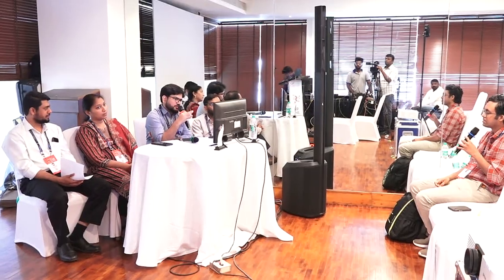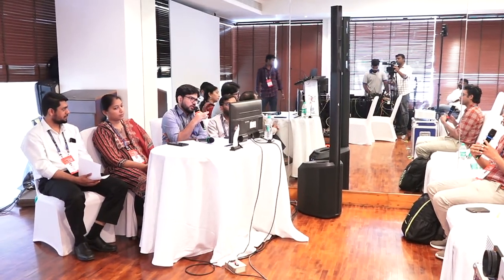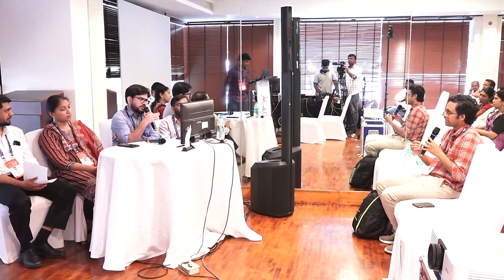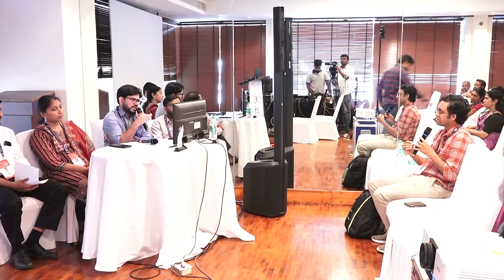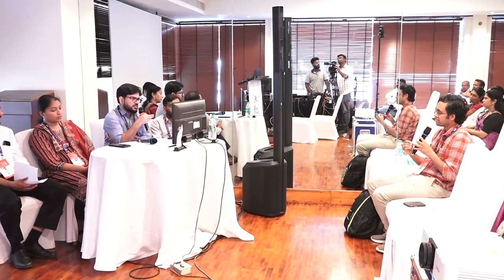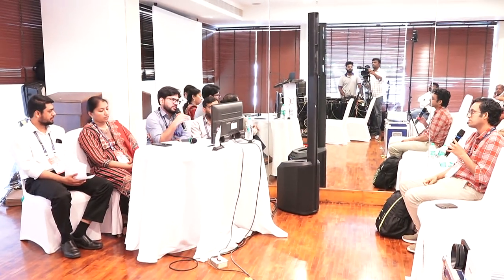In cases of a fulminant IIH, wherein the vision is also low, I would repeat the OCT in 2 weeks' time itself. Fulminant means the visual loss will be rapid in these cases. So I need to see the patient early and inform the neurologist that you need to be aggressive with the treatment.